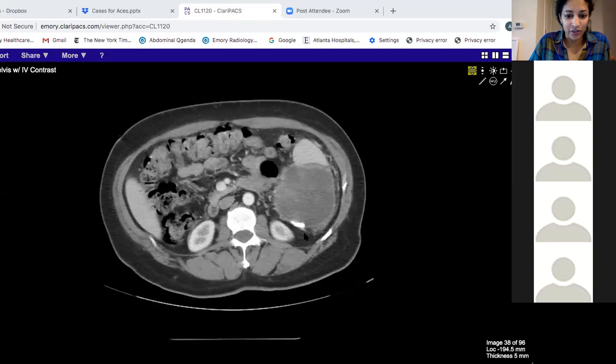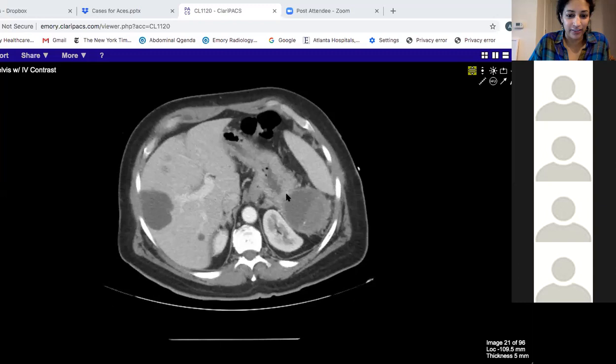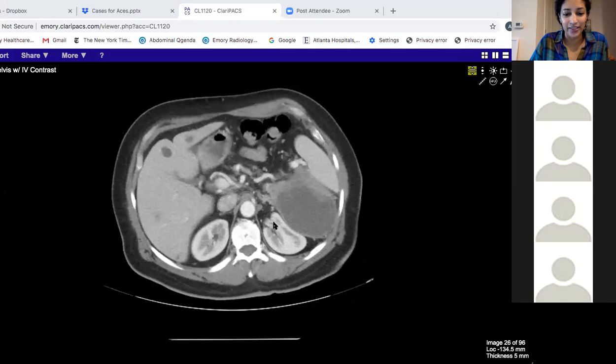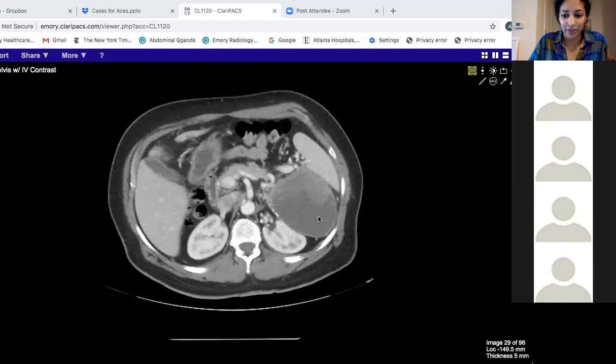The only real organ this mass seemed to be touching was the stomach over here. Michelle is asking about the adrenal gland — the adrenal gland was here. It's a good thought for something kind of more medially, but that would be a very, very exophytic adrenal tumor. But that's a really good thought.